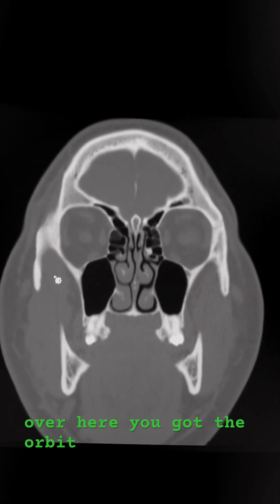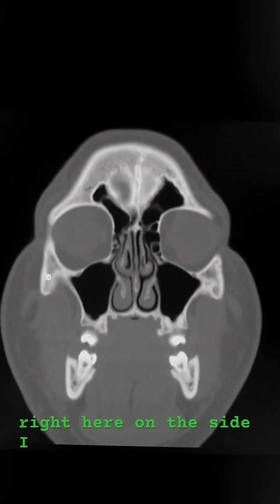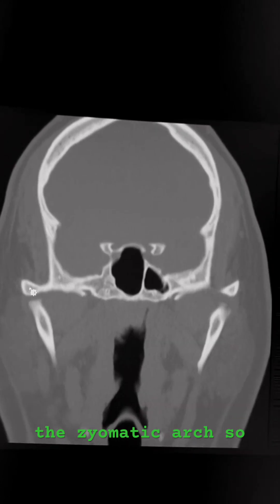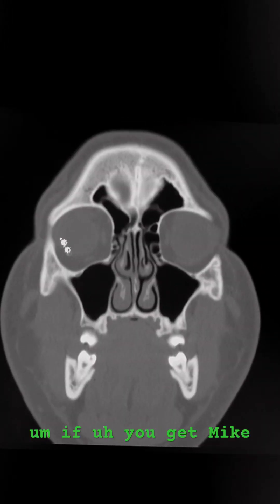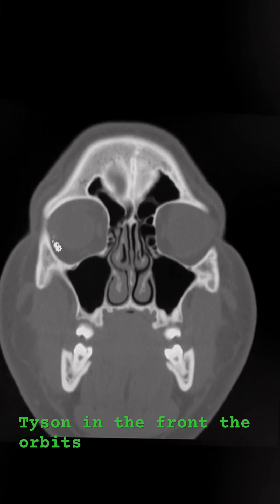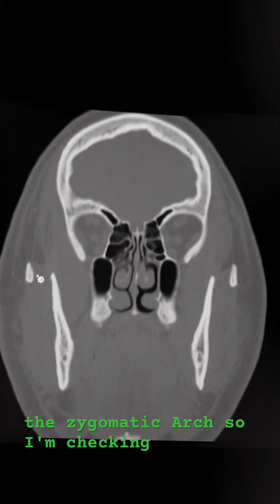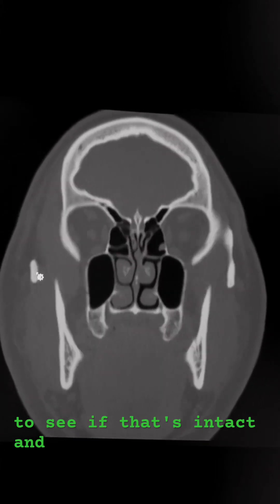Over here you've got the orbit on the side. Grab this right here — that's the zygomatic arch. So if you get hit by Mike Tyson in the front, the orbits take the impact. If he comes at you from the side, we're looking at the zygomatic arch. So I'm checking to see if that's intact.